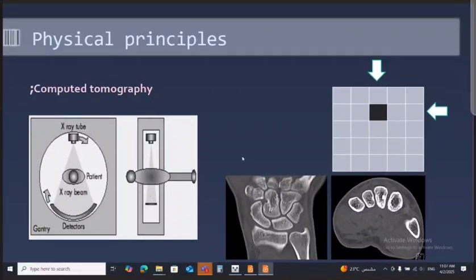In order to have a cross section, we have to locate every point in the section, and so the organ should be imaged or pictured from different angles. In order to localize a certain opaque structure, we should have multiple views from multiple angles of this object to localize the site of the object.